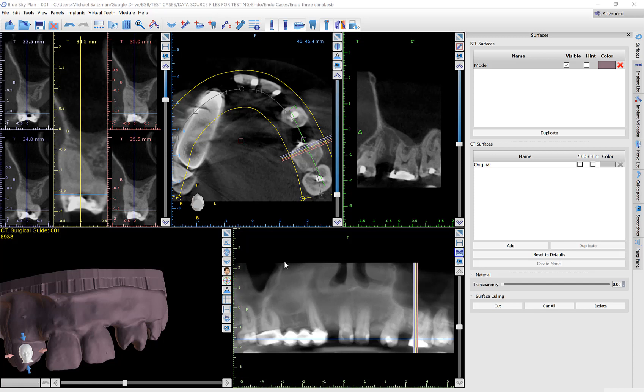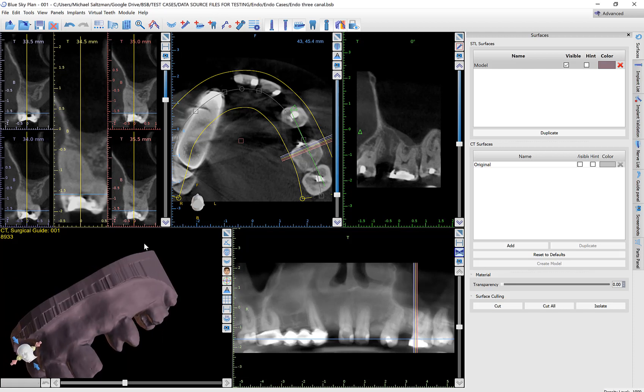Hello everyone, this is Michael Saltzman from Blue Sky Bio. While we don't yet have a dedicated endo module in the software, I wanted to demonstrate some features and functionality that will simplify the process of creating an endo guide in the current surgical guide module of Blue Sky Plan. I understand there are different techniques of creating a guide, either to access the entry of the canal or to create a guide to access lower down in the canal or possibly using multiple guides. I'm not going to be going into that, but I do recommend and invite clinicians who are using the software to create endo guides to show how they're using the software with the best clinical techniques that they recommend.